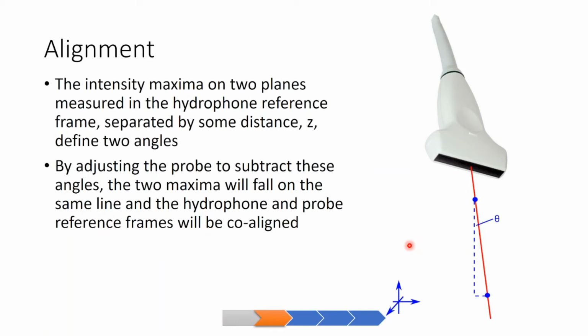So we're trying to characterize a large three-dimensional field with a series of one-dimensional and two-dimensional acquisitions. This is done simply to lower the magnitude of the information we need to capture to characterize this field. To do a good alignment, it's very important that we can align both our horizontal and vertical, our parallel and perpendicular axes where we're going to acquire our data going forward.